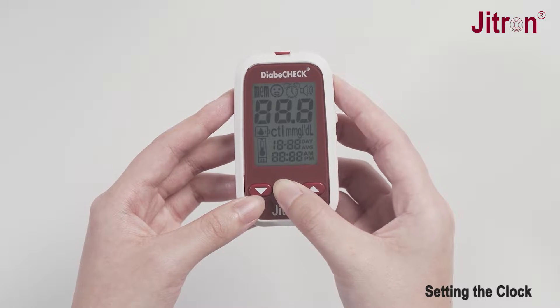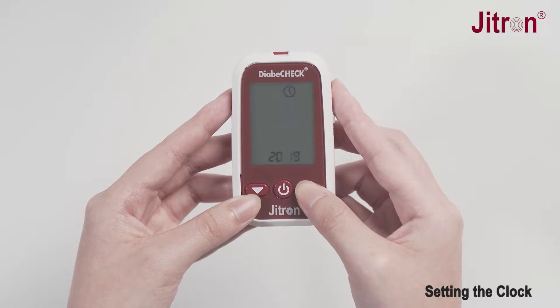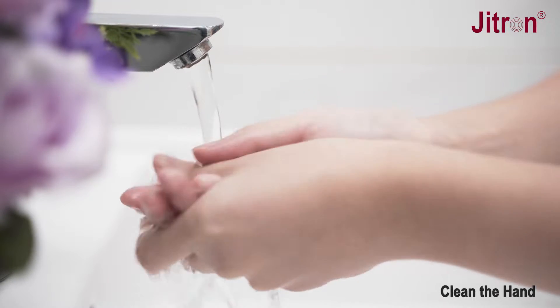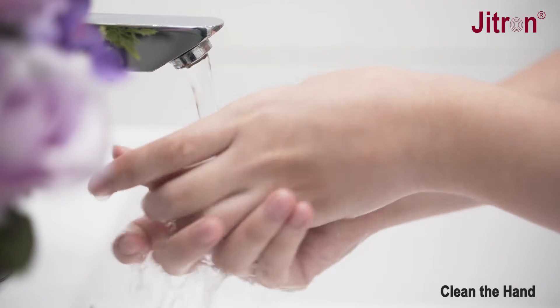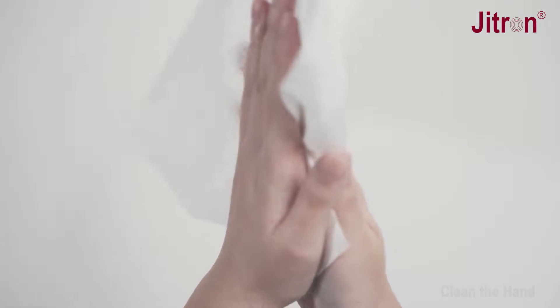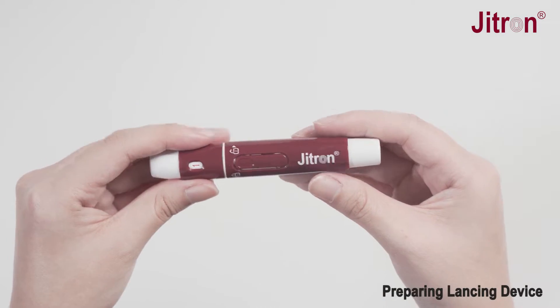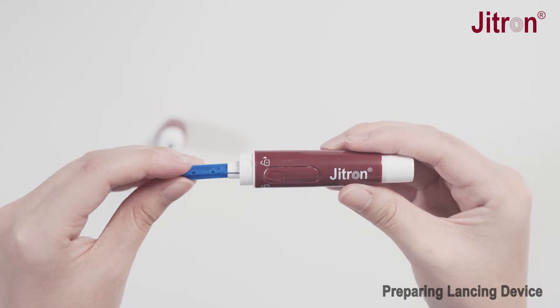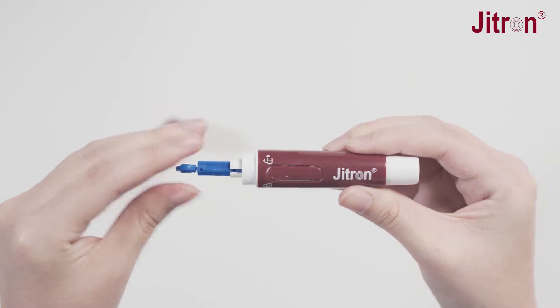Before you begin, make sure that the date and time on the meter are set up correctly. Please clean your hands with soap and warm water and dry them thoroughly. Set up the lancing device by inserting the lancet and setting a suitable depth of penetration for your skin type.